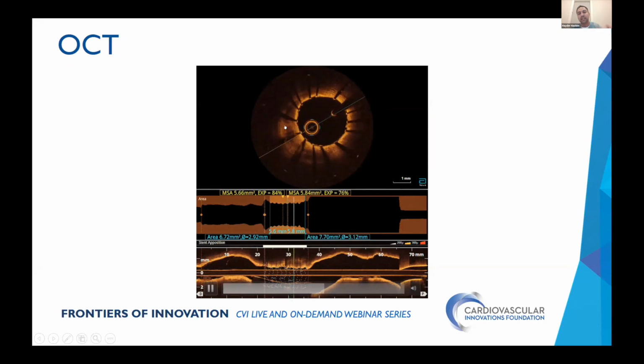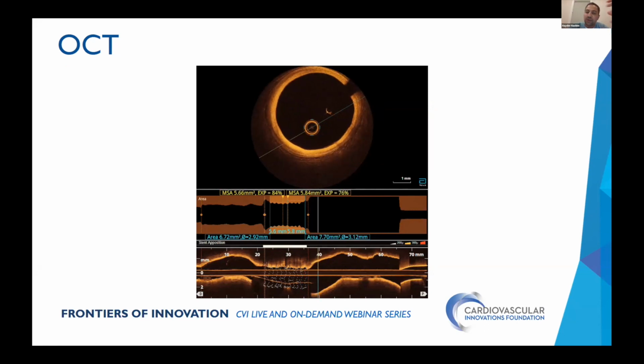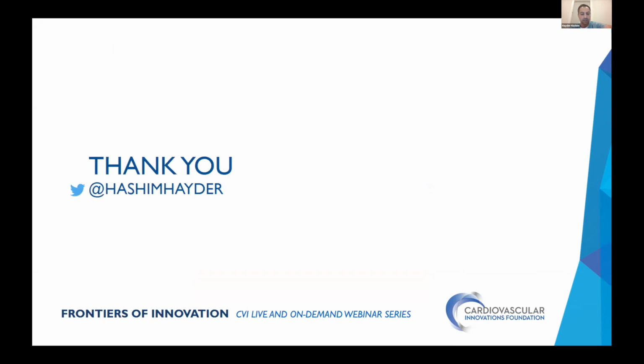But I felt that integrating physiology, integrating IVUS, now I think taking those patients based on the ISCHEMIA trial with angina and single vessel CAD on stress or CT scan is not enough to make a decision. And I think the future will carry more interrogation before we make a decision to put in any stent. And with that, I'll conclude. I'm probably a few minutes over.